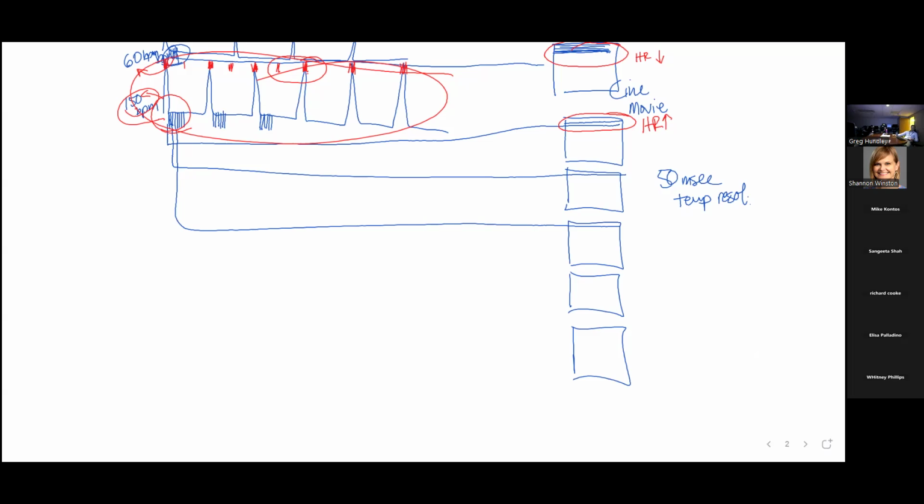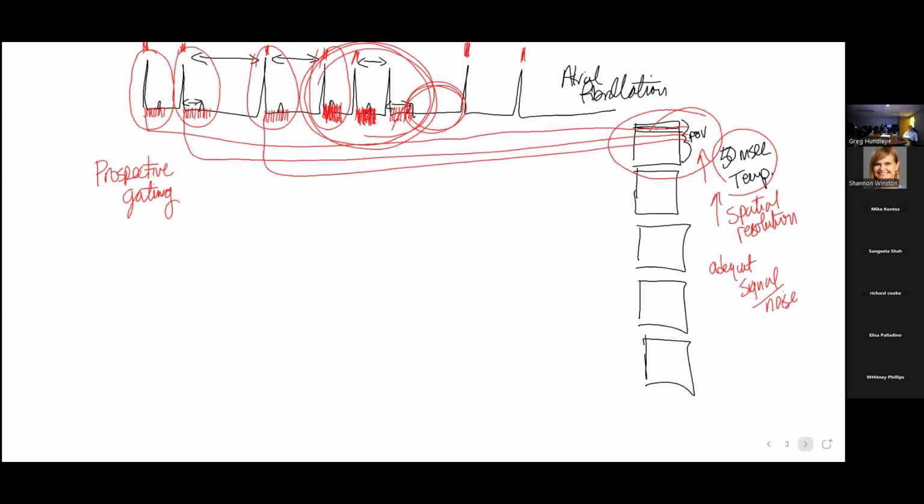Next slide. Now we get into irregular heart rates. The most common one you're going to run into is atrial fibrillation. Sometimes atrial fibrillation is very regular, and you can use the retrospective gating, but if not, you switch over to prospective gating. And the scanner is going to sound different. It's not broken. It's going to go, mah, mah, mah, mah. It's going to trigger on each QRS complex. It's working perfectly because the duration of systole remains constant. And the images turn out really nice.